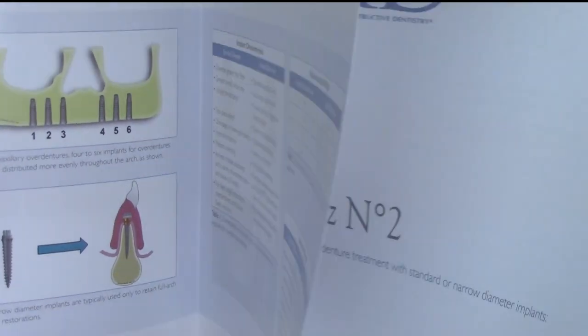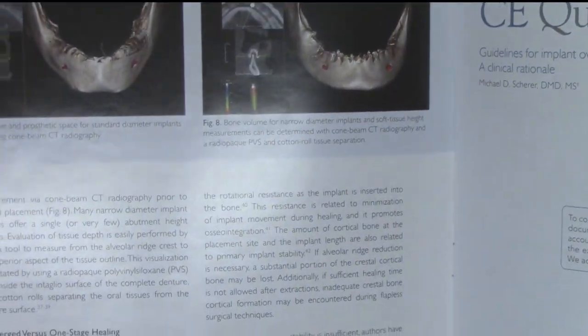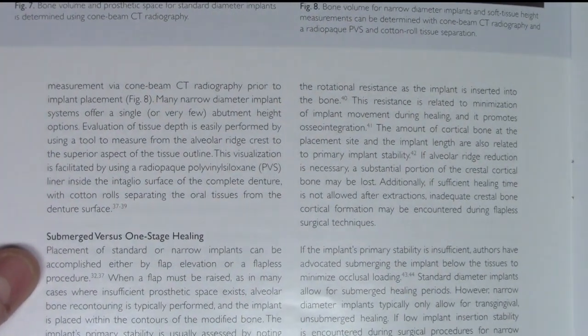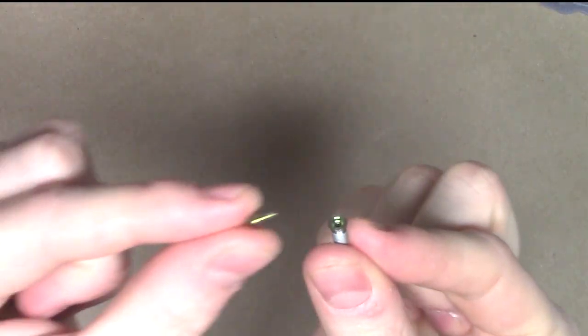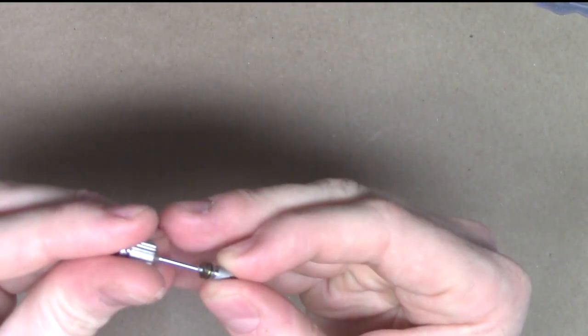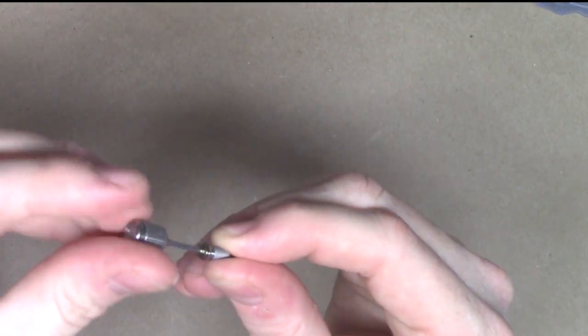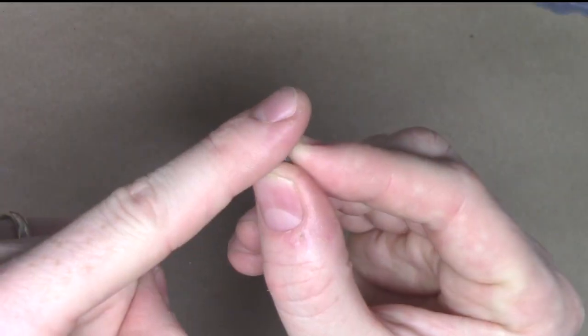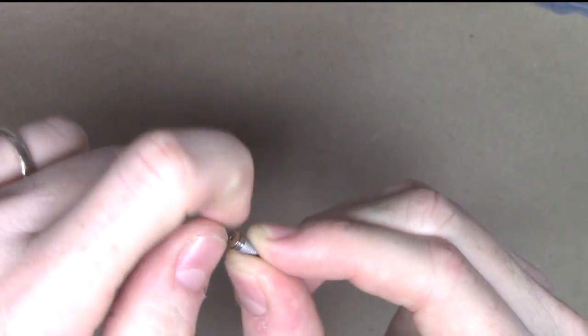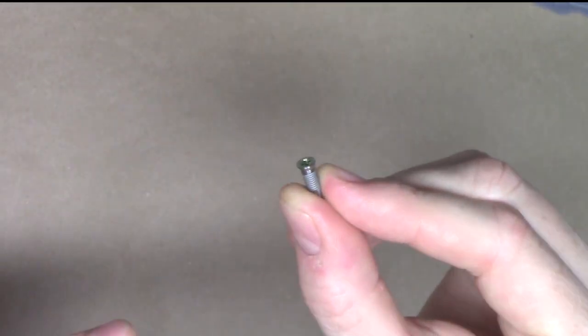As we go through this article just a little bit more, we know that we can also do something called submerged versus one-stage healing. We also know that, as I showed you before, because of our implant prosthetic options, our standard diameter implants can accept a cover screw. And as I take my little driver, we can attach a cover screw when the implant is in the mouth, and the implant can heal below the soft tissue, having submerged healing undisturbed in the mouth.